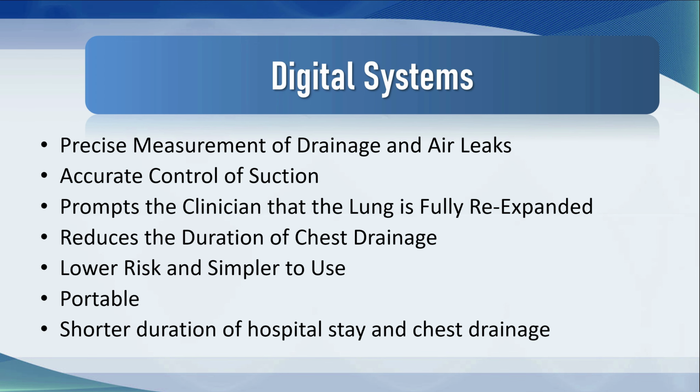In terms of guidance for the UK NICE system, the digital system is recommended after pulmonary resection or pneumothorax because it can reduce drainage time and length of stay in the hospital, improve safety for people with chest drains. It also may improve clinical decision making through continuous objective monitoring of air leaks and fluid loss.